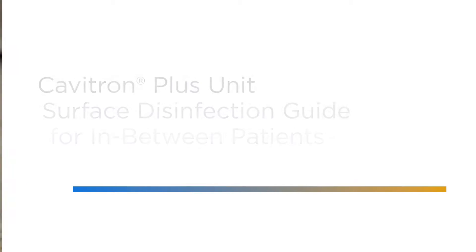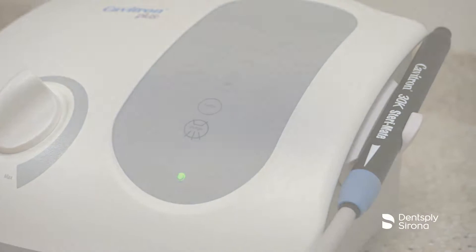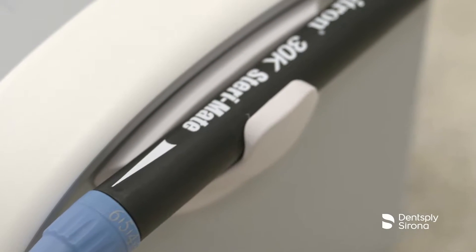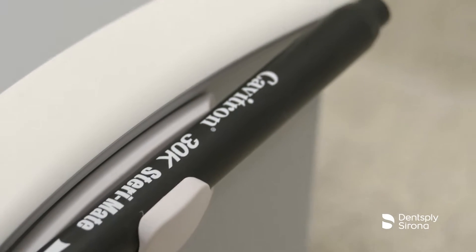After utilizing the Cavitron Plus Ultrasonic Scaler, it is essential to disinfect all of the surfaces of the unit and its surrounding environment in between patients. This important step will reduce the risk of cross-contamination.